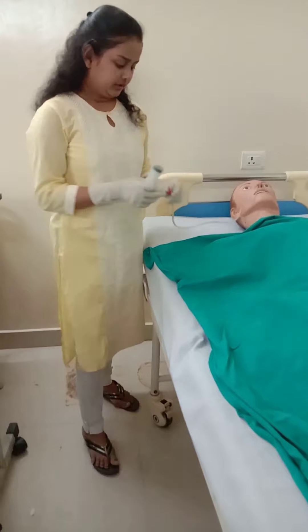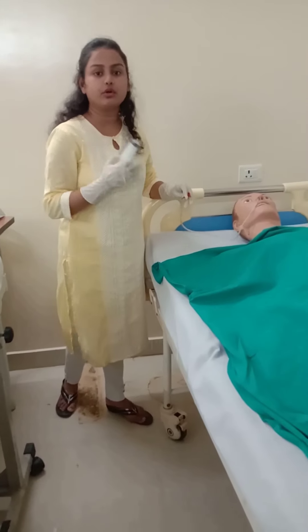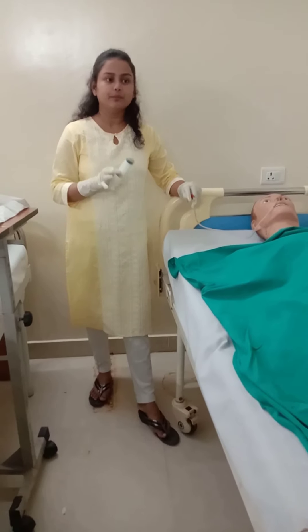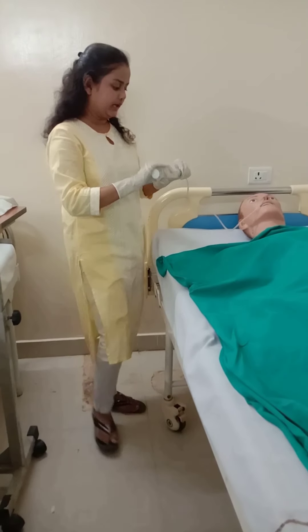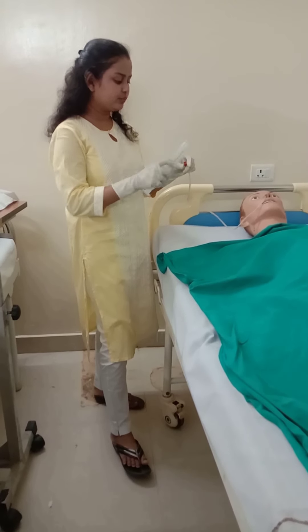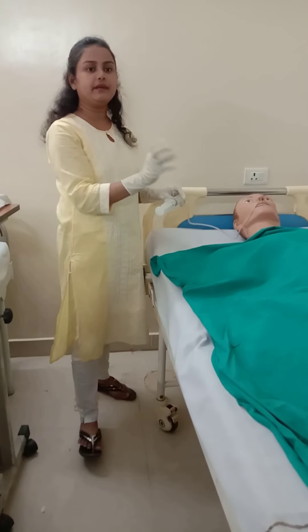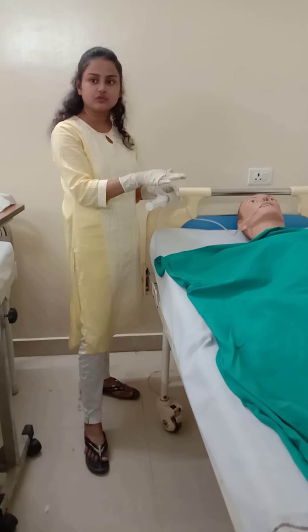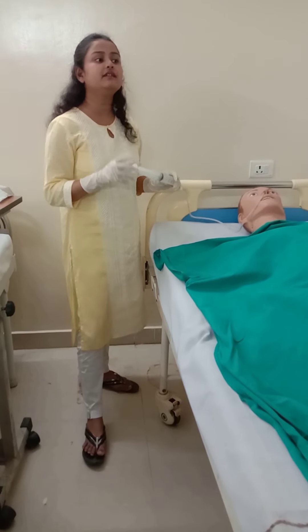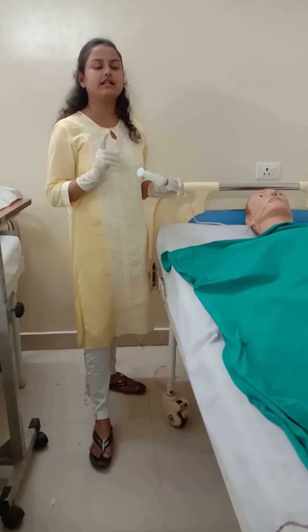To verify correct placement, take a syringe and forcefully push air into the Ryle's tube. At the same moment, auscultate for a gushing sound in the epigastric region by placing a stethoscope there. Push air into the Ryle's tube and at the same time place the stethoscope on the epigastric region. If the gushing sound is heard in the stomach, the Ryle's tube is correctly placed in the stomach.